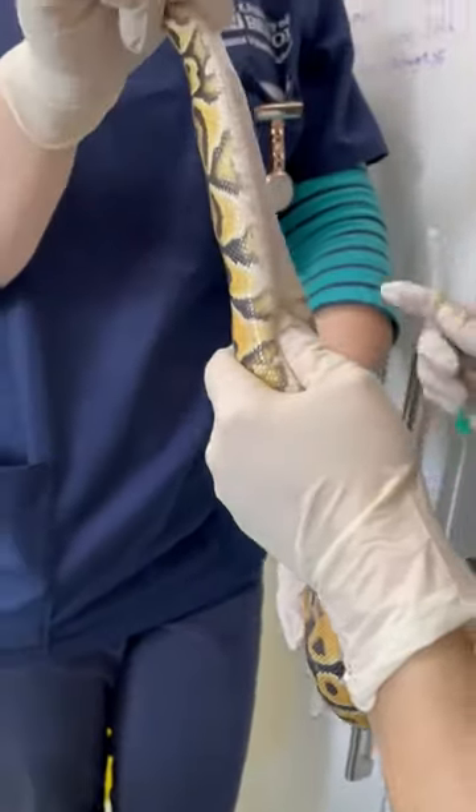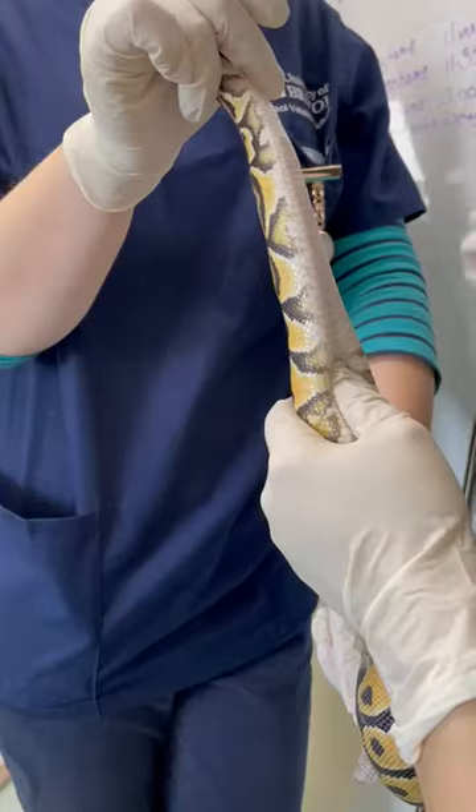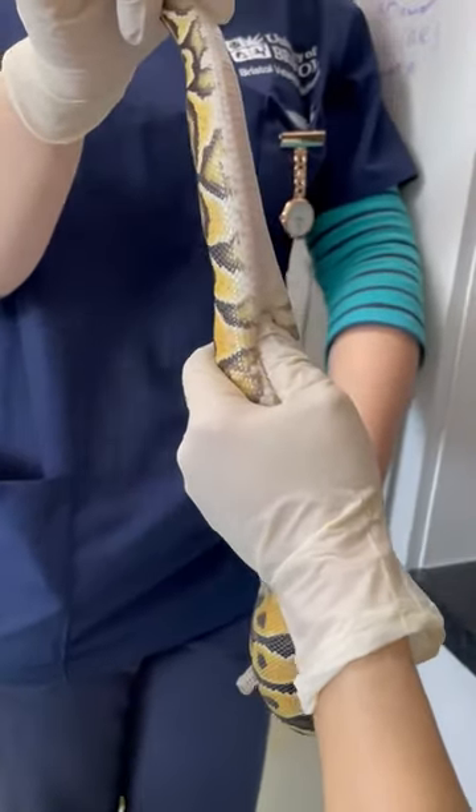We've located the heart. It's about 20% from his snout down to the vent length. So what I've done is I've found the heart.